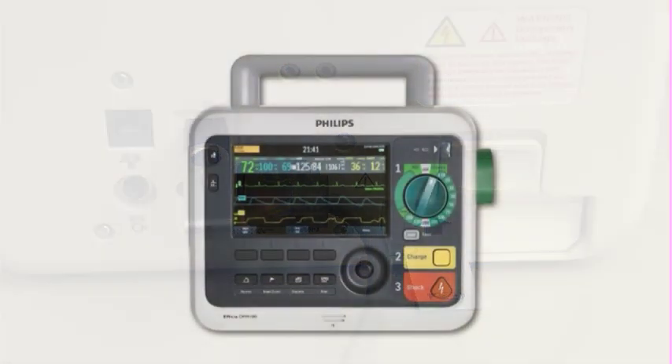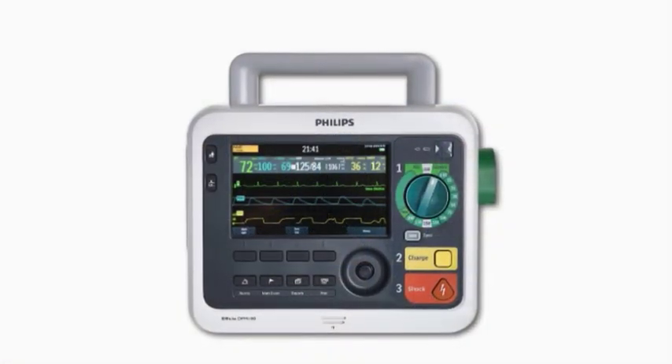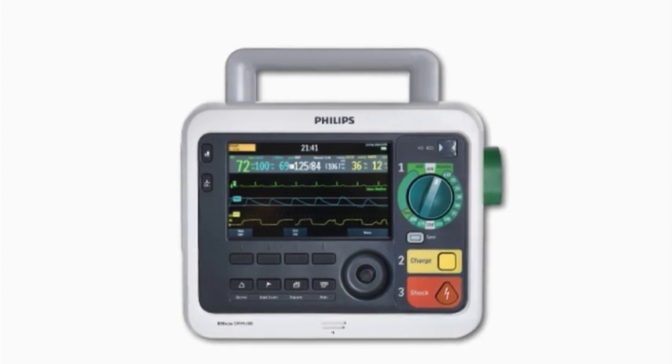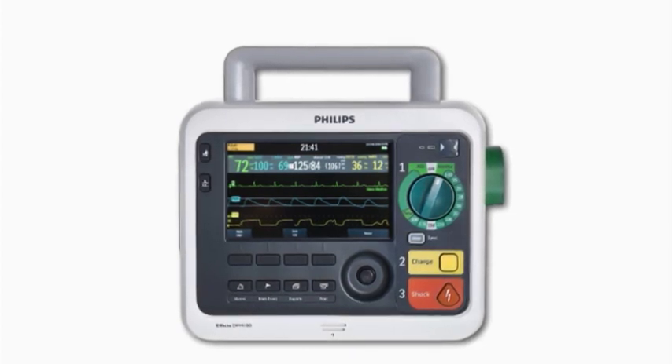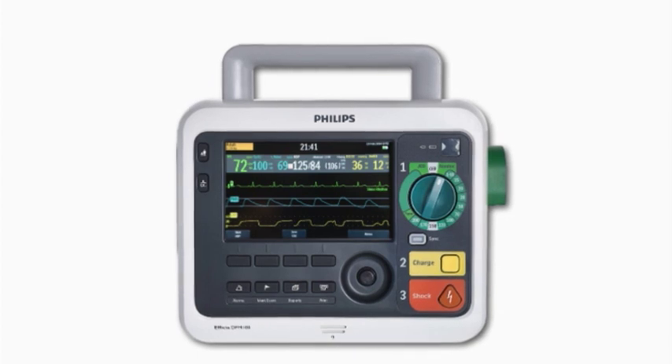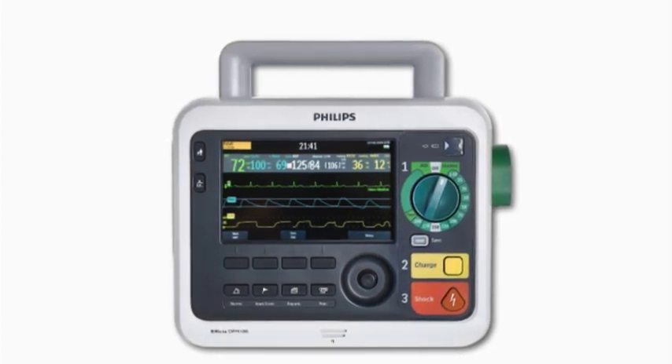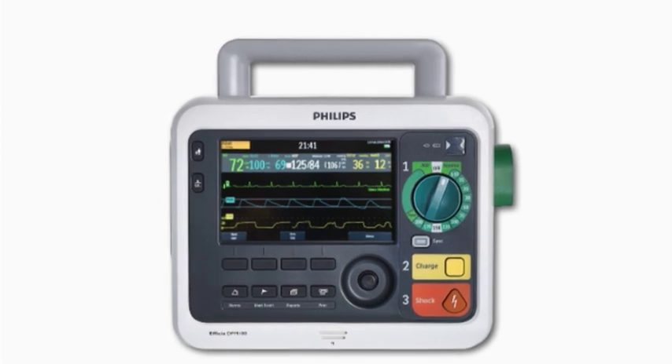No matter where you work, the DFM100 can be configured to meet your clinical needs. For this program, we'll demonstrate operation using the default configuration settings. Be sure to familiarize yourself with your device's configuration before using the DFM100.